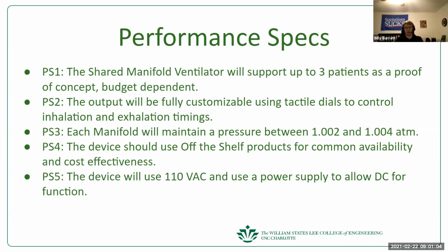We've got it to that specification specifically. Okay, great. And then for the oxygen loop, pretty much just dependent on the oxygen tank pressure. For the air manifold, that would be probably a mechanical question.